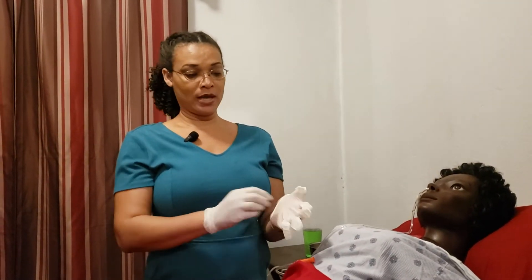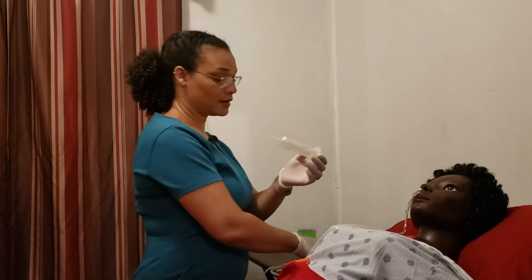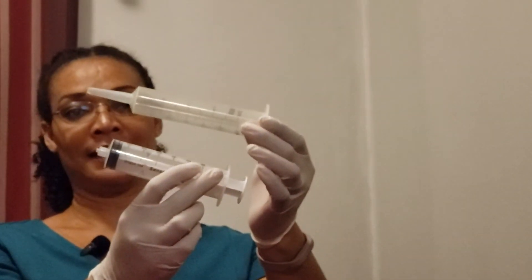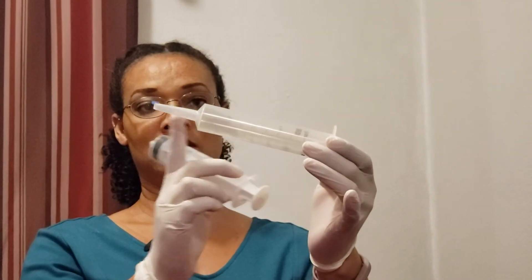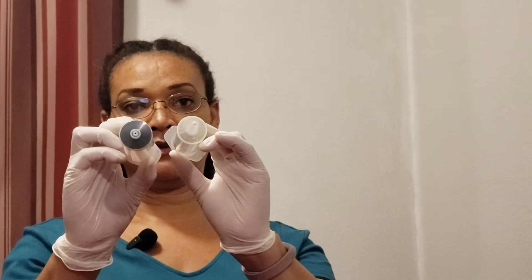To start the procedure, we apply clean gloves. Our 60 cc syringe with the special catheter tip is this one — notice the normal syringe is the one that attaches a needle. The one we need for feeding has a wider lumen, so thick feeds can also be tolerated better.